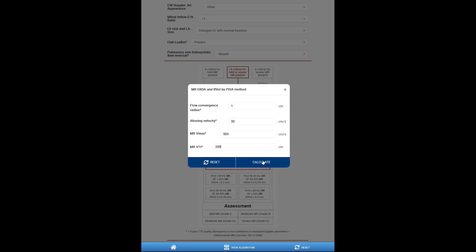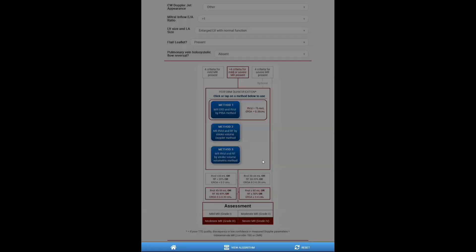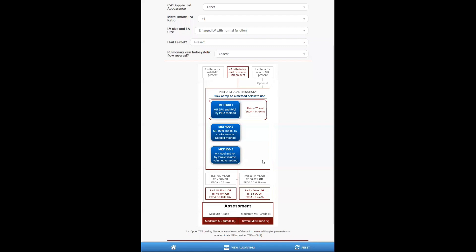So after I enter my parameters, I can calculate, and it takes us back to the algorithm where it provides quantitative data, EROA and regurgitation volume, and the grading. In this case, based on these two, there's a discrepancy, and then the user will need to make a clinical decision based on other parameters.